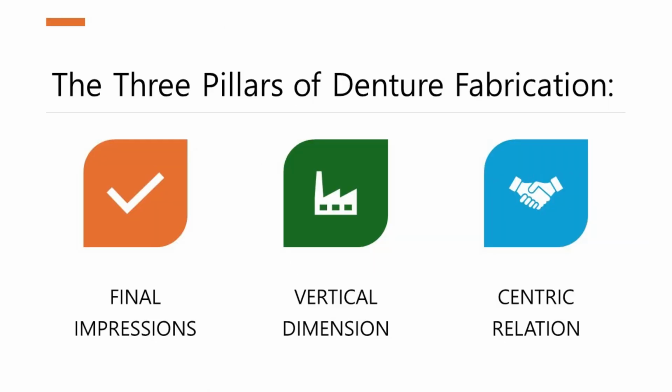In the intricate process of crafting dentures, three foundational steps are paramount to achieving a successful outcome: final impressions, vertical dimension, and centric relation.